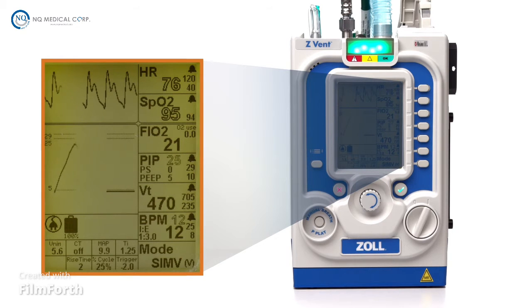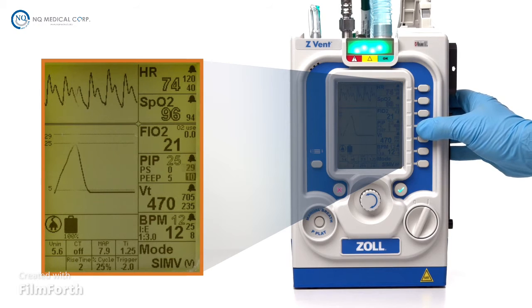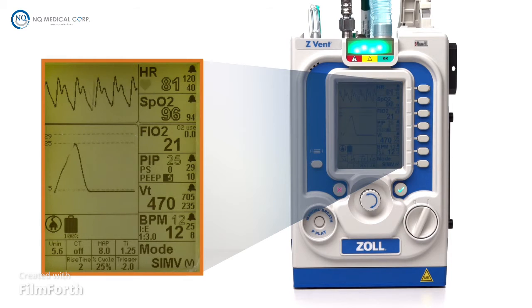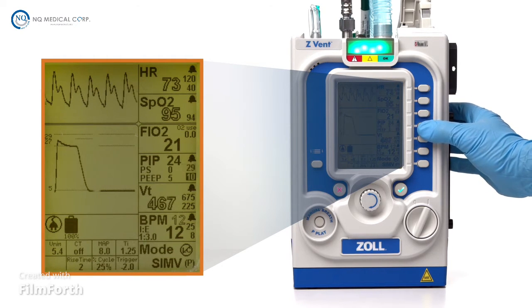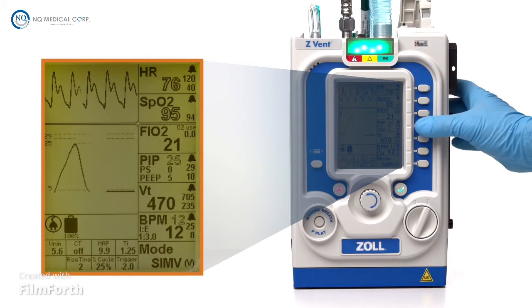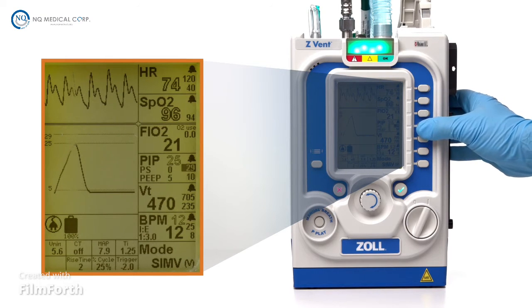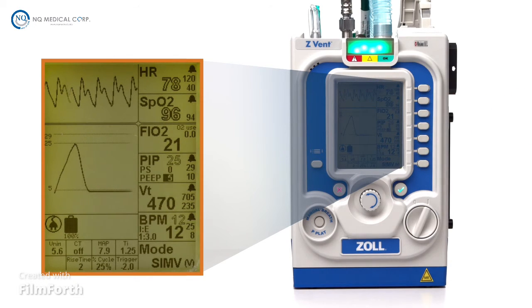When operating in a volume-targeted breathing mode, PIP is a calculated value and will display as an outlined number that cannot be changed. In pressure-targeted breathing, press the parameter button once to change the desired PIP, twice to change the high pressure limit, 3 times to change the low pressure limit, and 4 times to change the PEEP. In volume-targeted breathing, press the parameter button once to change the high pressure limit, twice to change the low pressure limit, and 3 times to change the PEEP value.